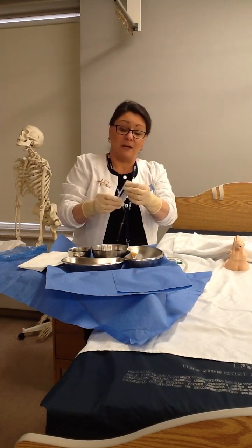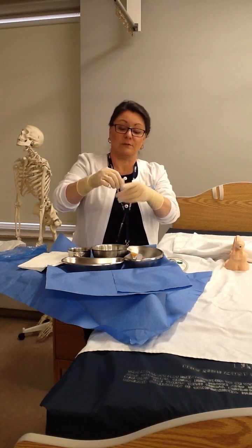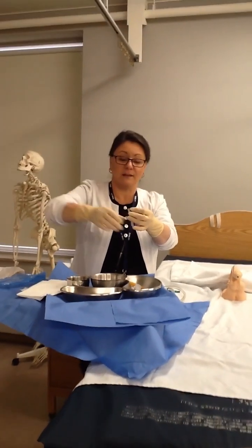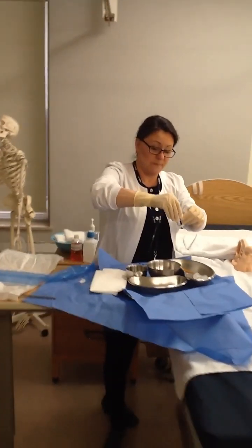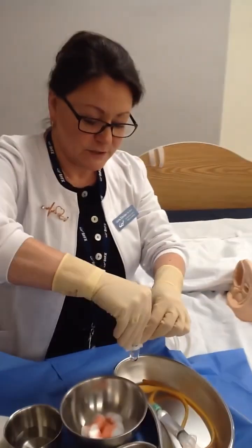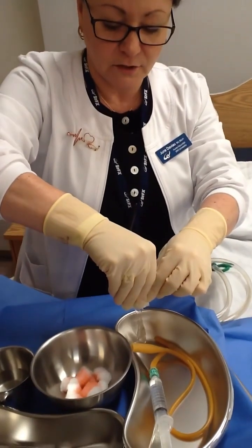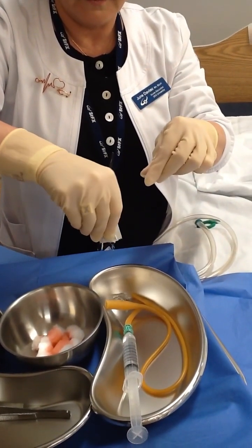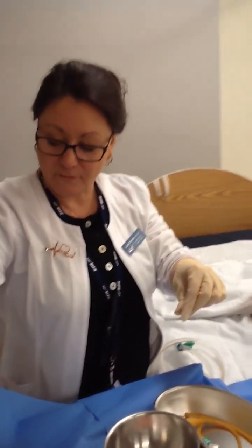And then I'm going to add my muco to the far little corner. So I'm just going to tear. This is all sterile, so it's okay. It can just drop right there. And I'm going to drop that little dollop of muco right into the bottom of the tray, right close to that end of my catheter. Okay, I'm just going to drop that right there.